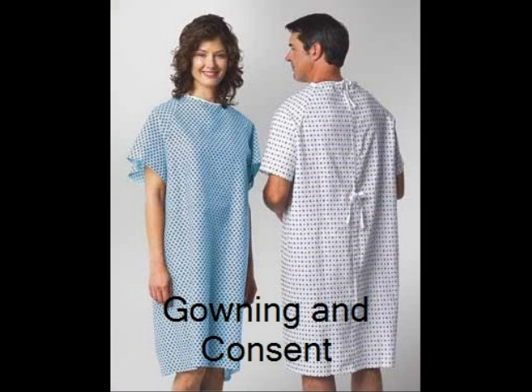Once the technologist brings the patient into the room, they should prepare them for the procedure by explaining the exam step by step. After the explanation, answering any questions they may have, the technologist will ask if the patient would like to continue. If they say yes, this is informed consent. They aren't required to sign any forms for this procedure, but their agreement and continued compliance implies consent.